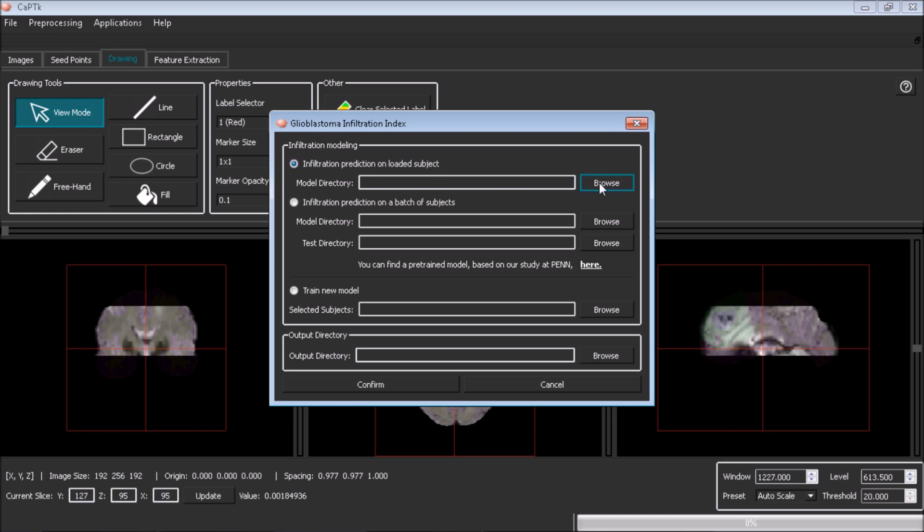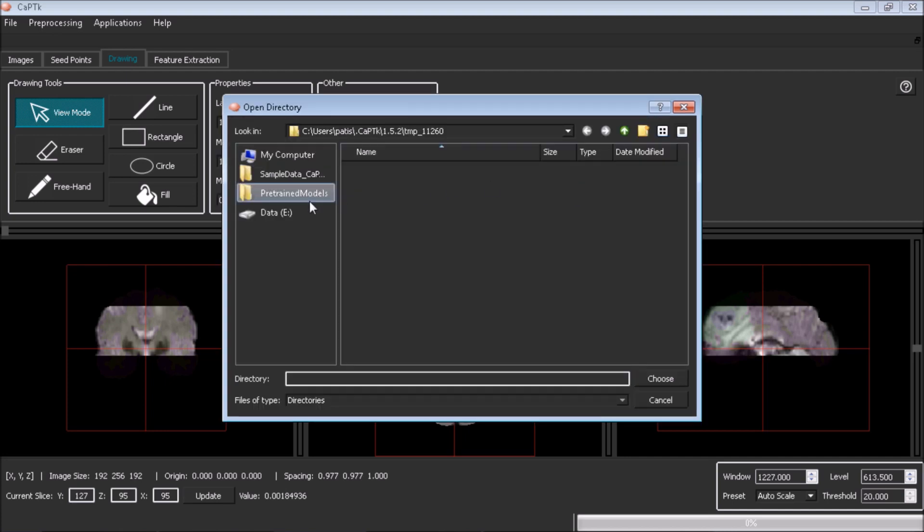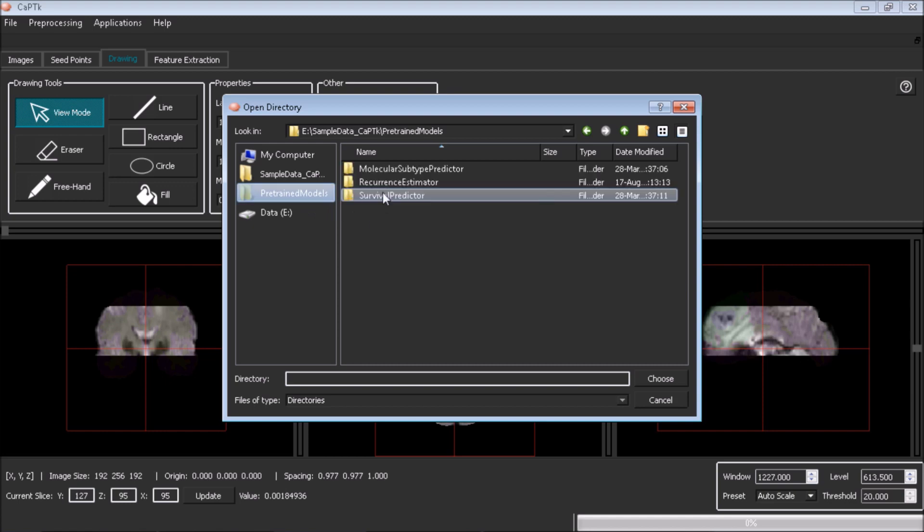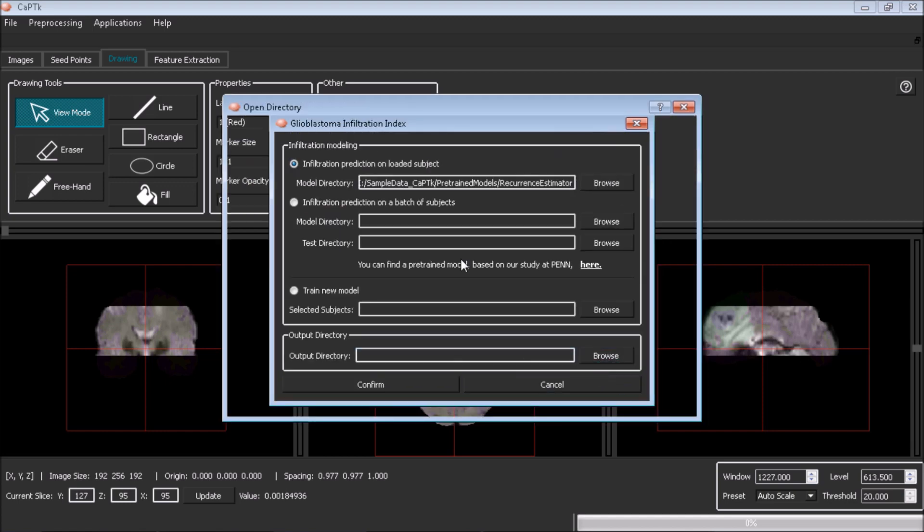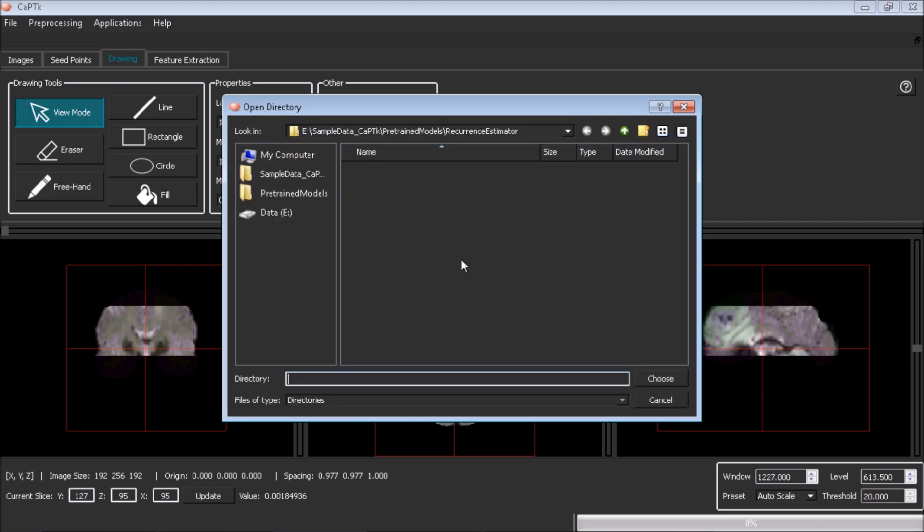Select the pre-trained model file, which can be downloaded separately and has been created from data from the Hospital of the University of Pennsylvania. Select the folder where output needs to be saved and hit Confirm.